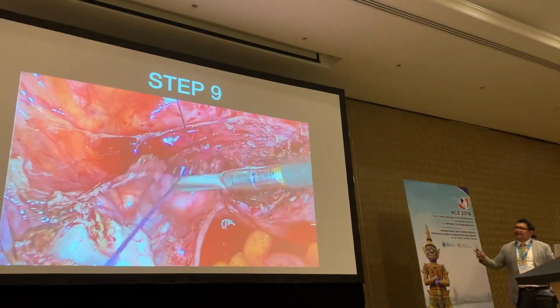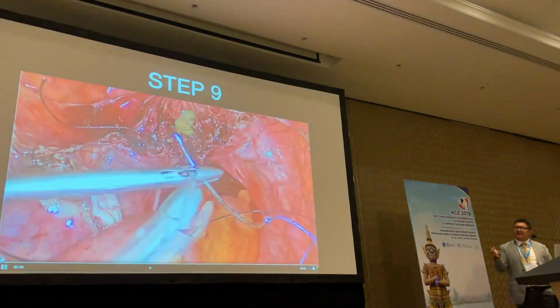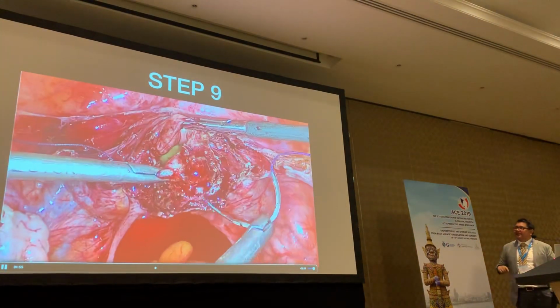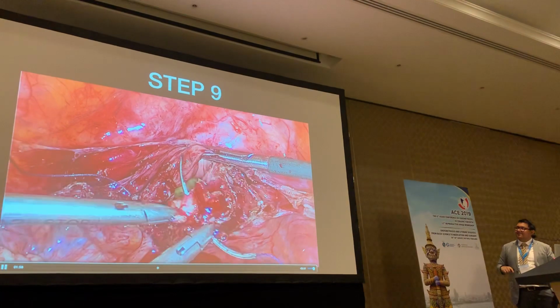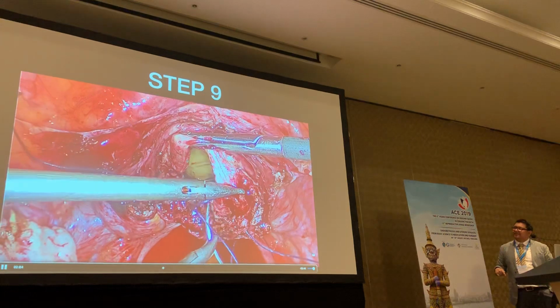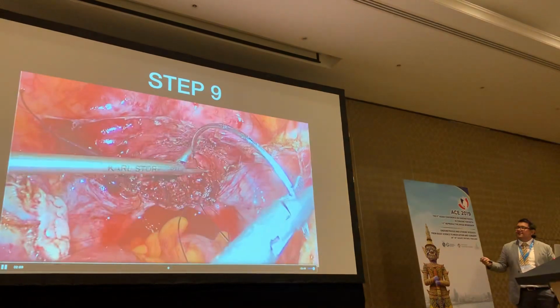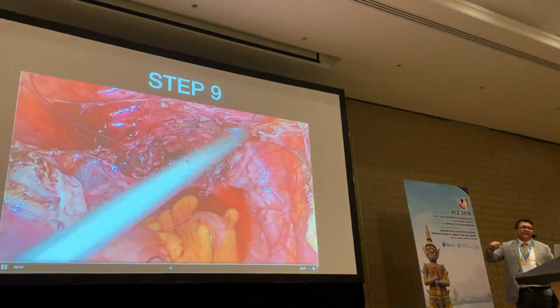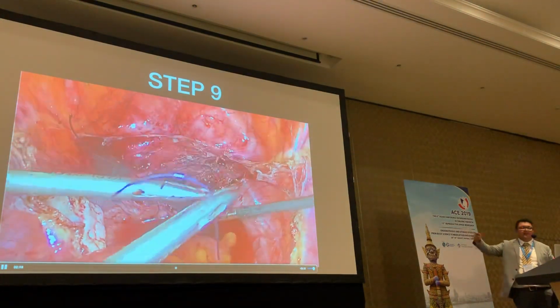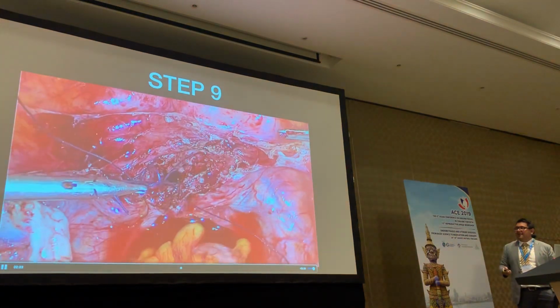So then we cut this end, and then I will begin from the right angle. This one I like to take with my right hand because the curve of the needle goes perfectly through 5 o'clock and 2 o'clock of the angle. Still take the uterosacral, and now you see with the right hand you can just swing it through. It's important for the angles to get a full thickness. You don't need to go too lateral and include the uterine pedicle, because if you coagulate it properly, and if you try to take the uterine there, there are very high chances of catching your ureter in that angle.